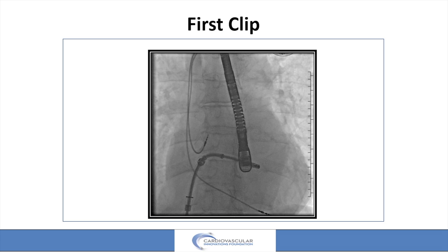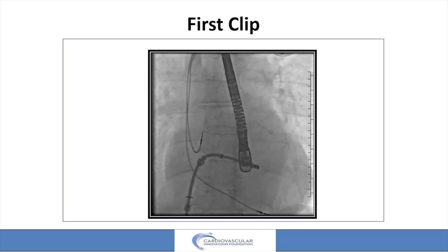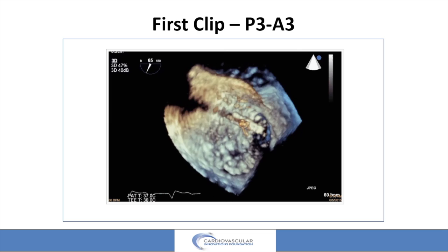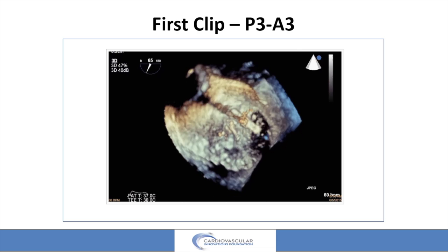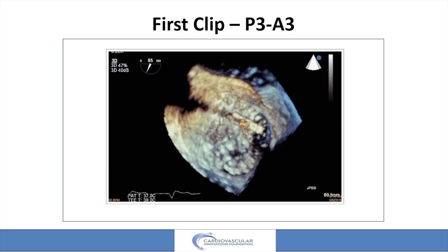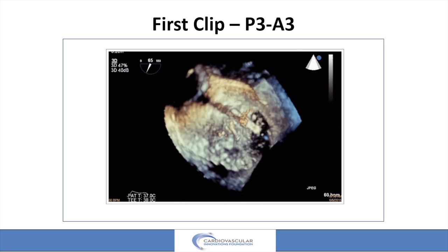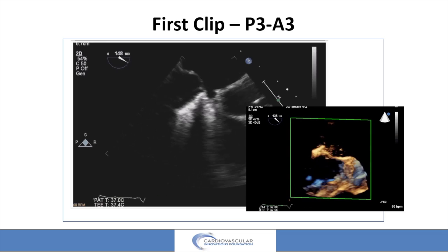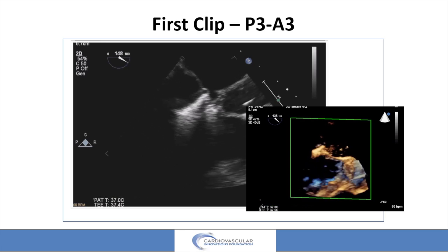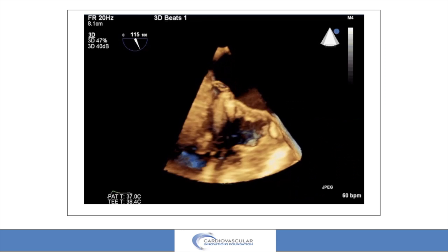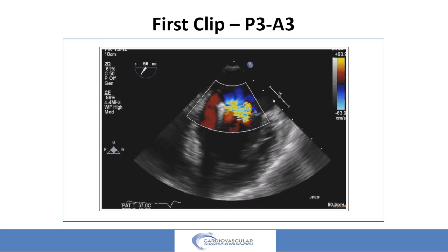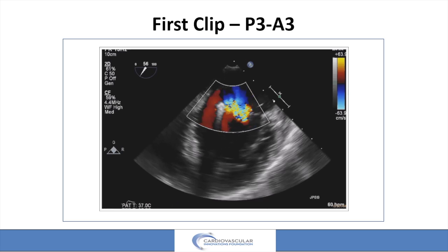Here's the first clip going in — we're back with another clip. Nicely aligned, we're probably on the lateral aspect of P3A3 here. When you get over here, the smile kind of goes up, so you want to be at 11-5, maybe even 10-4 with respect to the orientation of the clip if you're very medial. This is after the first grasp — we still got movement in that posterior leaflet but much less, and we've got a really good grasp. We've got no leak medial to this clip, still lots of leak lateral, which we expect.